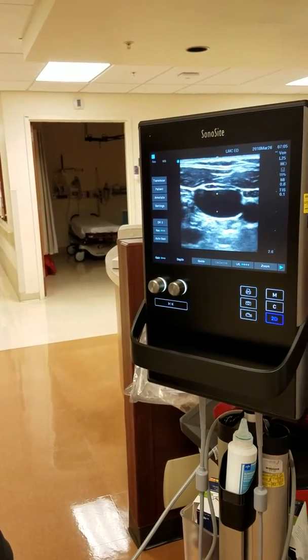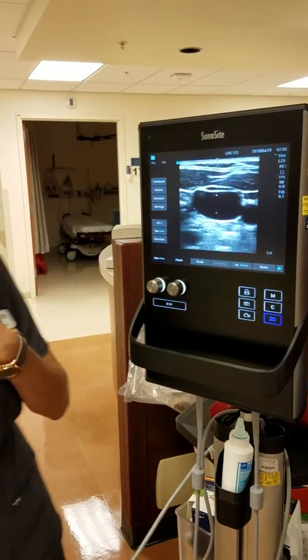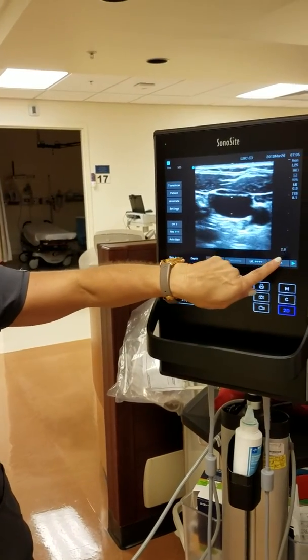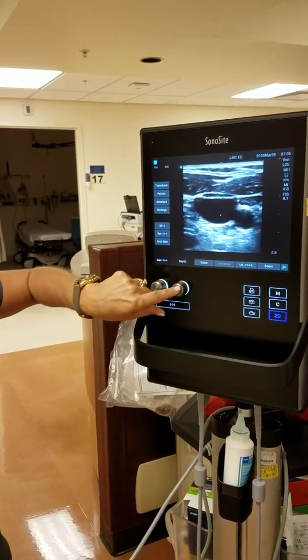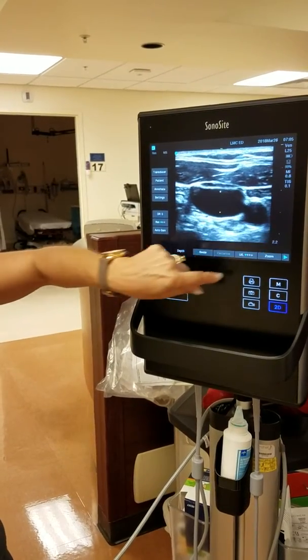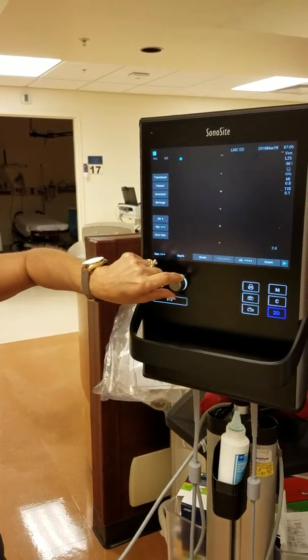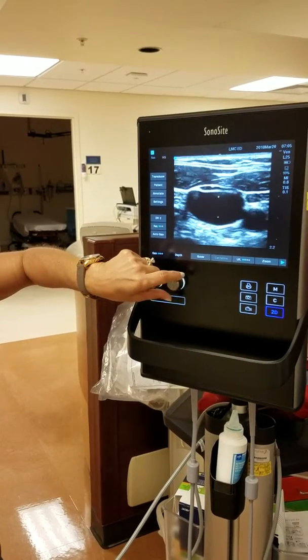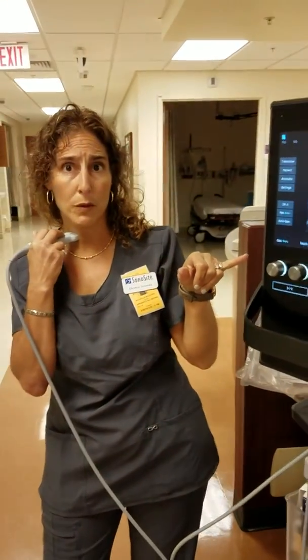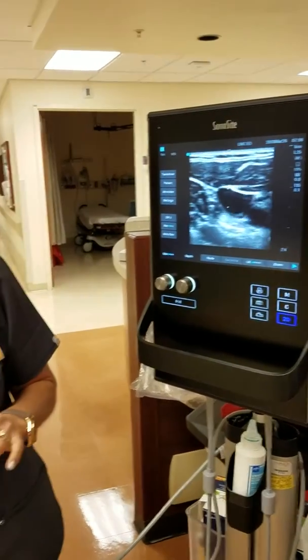Your second most important button is going to be your depth. This is where your skin surface and transducer meet, right here at the top. Right now it's going down to 2.6 centimeters deep. Turn the knob counterclockwise to go more shallow — 2.2, 1.9 — or turn the other way to go deeper. It's super important that you adjust your depth to optimize the image, and you want your area of interest to be as centered as possible.